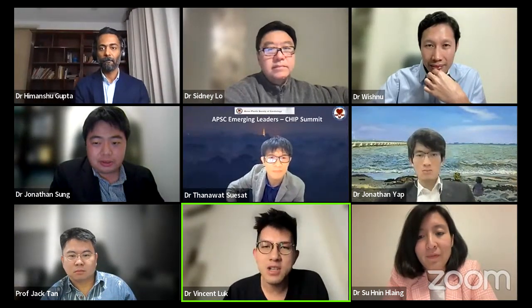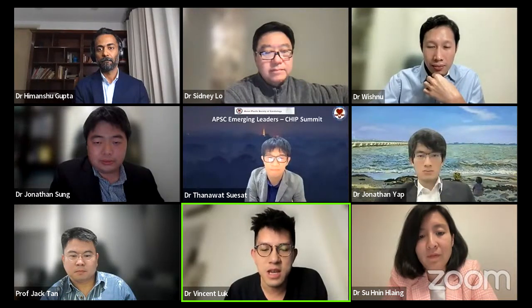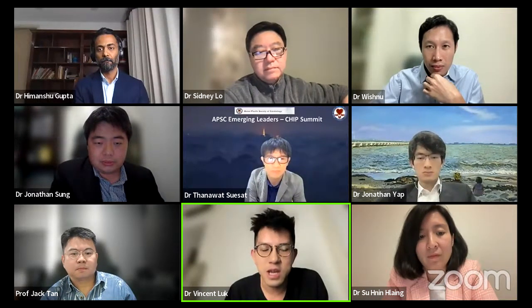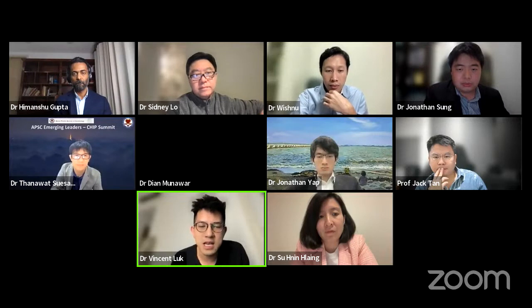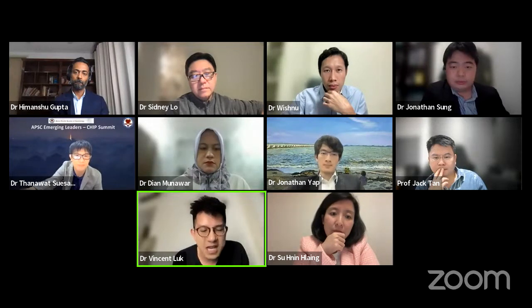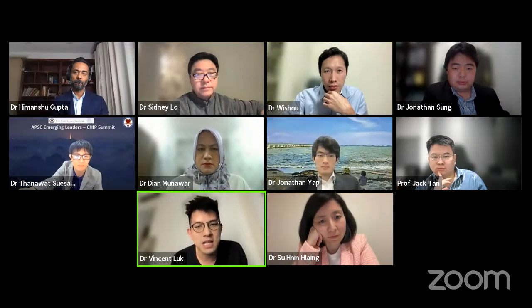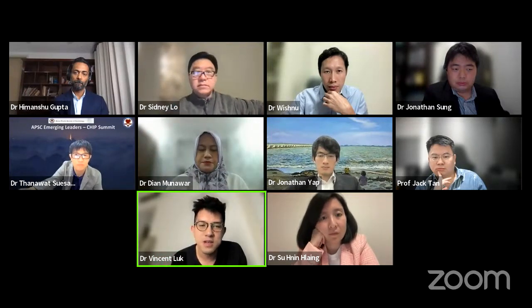Yeah, good. Usually, I think OCT for sure will tell us more, because it sees through with the higher penetration. So to me, if I can anticipate a lot of calcium in the angiogram, I tend to use OCT in most of the cases. Because with OCT, at least I can appreciate the thickness. And of course, sometimes when you use rotablator or IVL, then I can see the cracks in a little bit more detail. Sometimes when you do IVL and you do IVUS again, you may think you had made the cracks, but those micro fractures you can't really appreciate in IVUS. So if I have a choice, I would tend to use OCT in those cases.